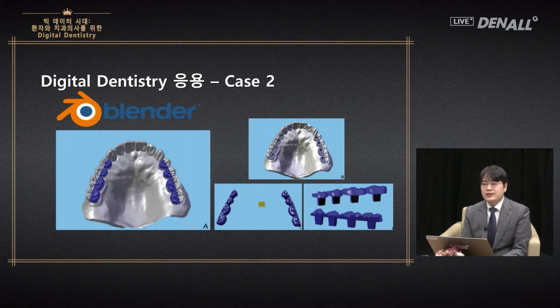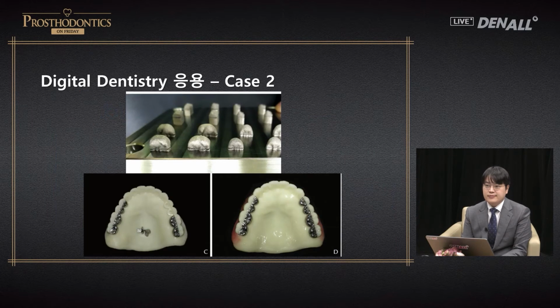So with the 3Shape, after making the complete denture for the maxilla, it is opened in Blender. Functional cusp vertices and other vertices are separated. Pin and hole vertices are created, and that will be cemented later. Functional cusp vertices are printed using a metal printer. Other vertices are printed with the resin printer. In this case, the digital lab work was done to increase the resistance to wearing.